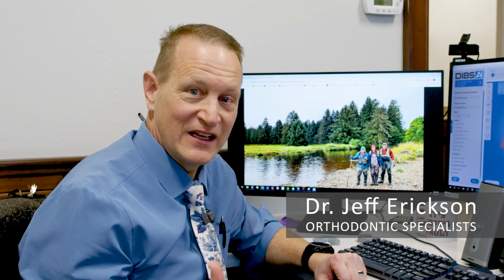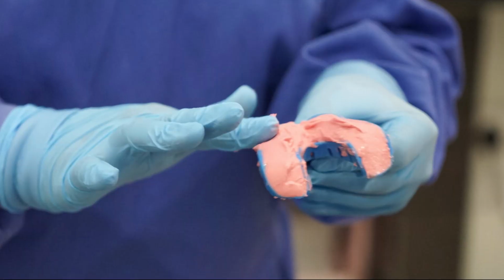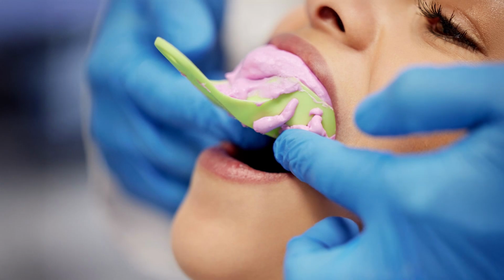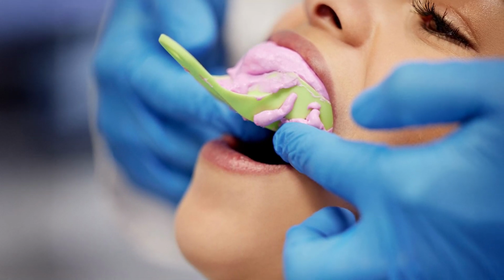It's really interesting and fun to see how technology has changed the way we do things in orthodontics. It used to be that we would take molds on people, and I hear people all the time as adults come and tell me how that was one of the most traumatic events of their childhood. One of the things that we do now, instead of taking those molds or impressions, is we scan patients.